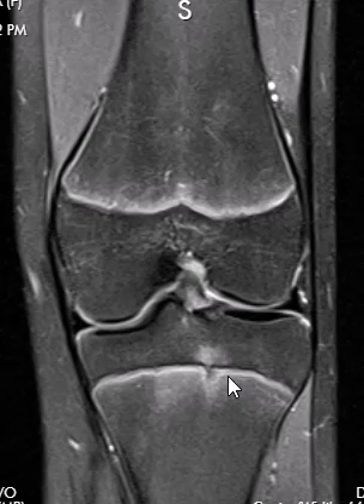This is called a FOPE zone — F-O-P-E — which stands for focal perifisial edema. It is believed to be just an area of early closure of the growth plate. It's got to start somewhere, and so they assume that it started right here. You can see the little contour deformity of the growth plate and the adjacent marrow edema.